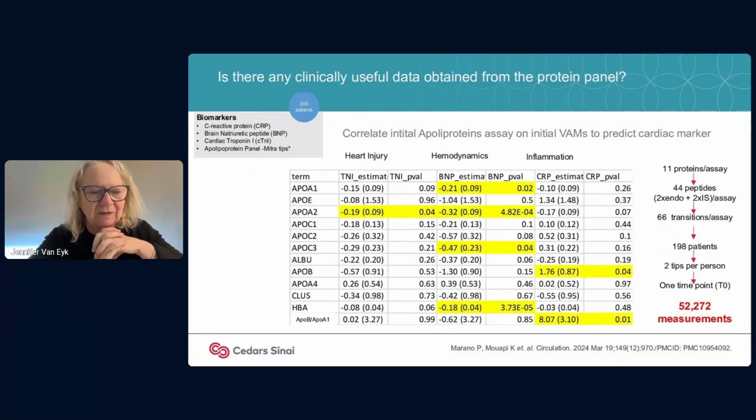But I also just wanted to point out the amount of chemical data, analytical concentration-dependent data that one obtains. So as I mentioned, it's an 11 protein assay. We're measuring 22 endogenous peptides. But of course, we also have the cells.